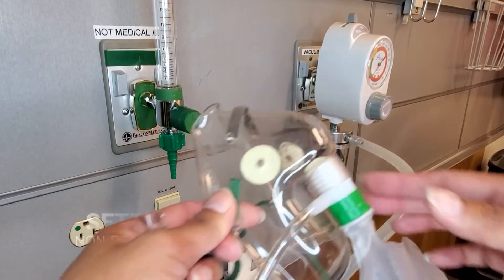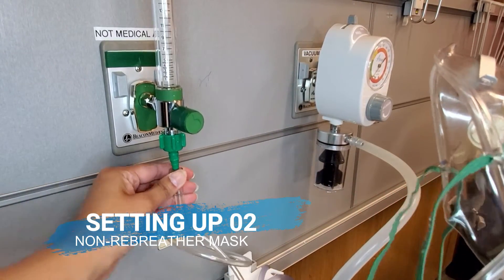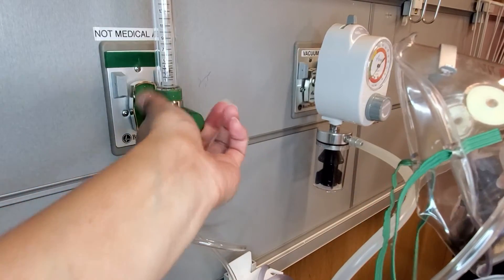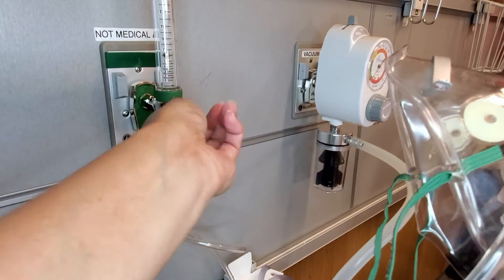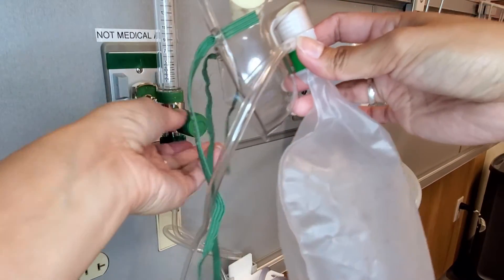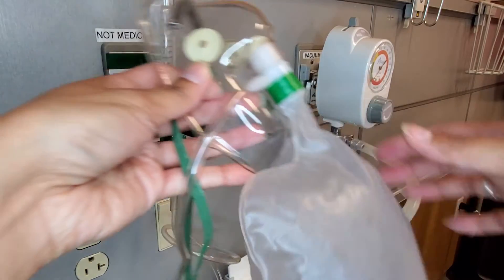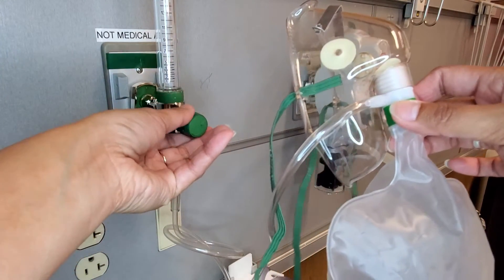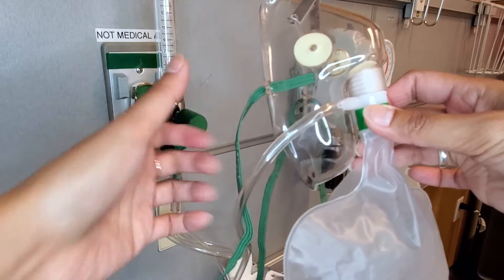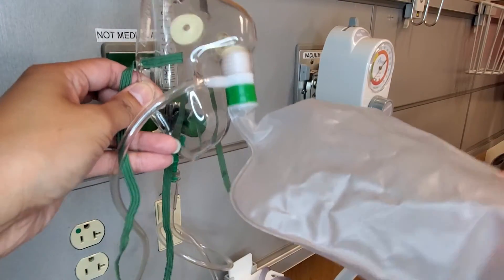To set up a non-rebreather, connect the tubing to the flow meter, increase to 10 to 15 liters, and fill up the bag so it is fully inflated. Set it at the correct oxygen liters per minute as per order and now you can put it on your patient.